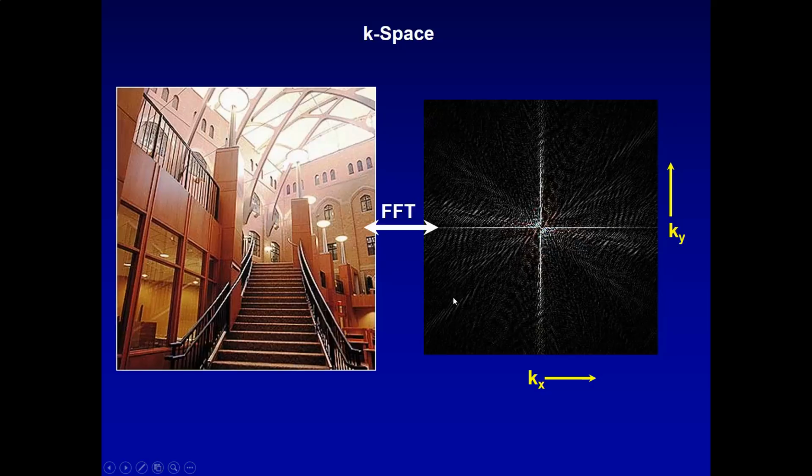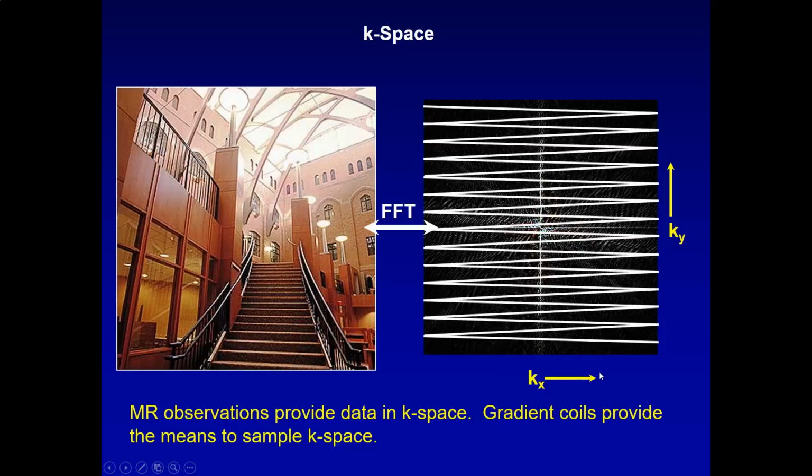The signals out here, those represent all the little details in the picture. So let's say we have Kx and Ky. I'll talk most about that in MRI, but there's also a Kz. That would correspond to the up and down or across in the magnet, and from head to the foot in the magnet.